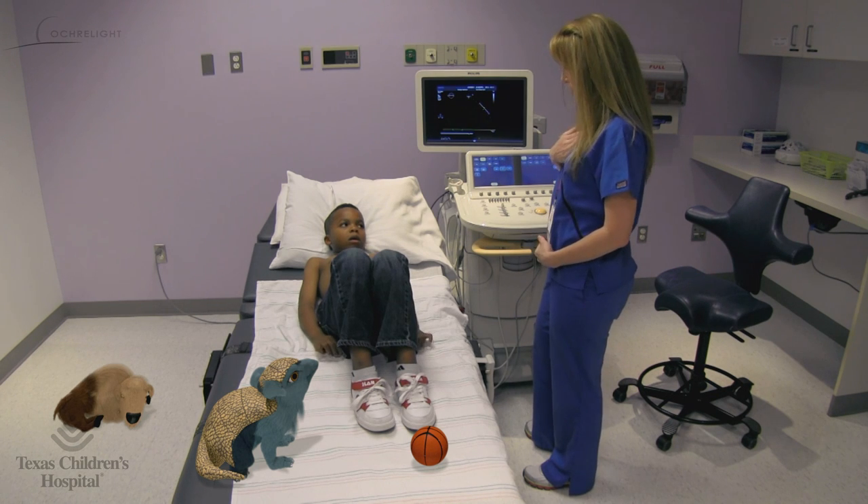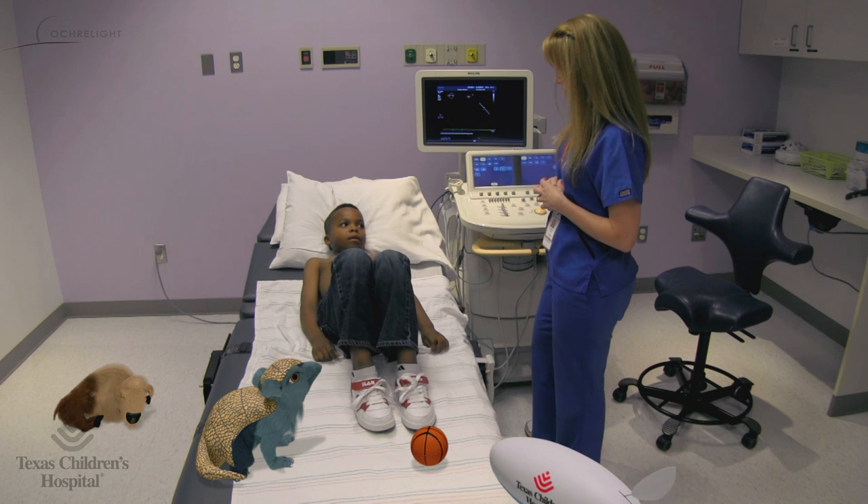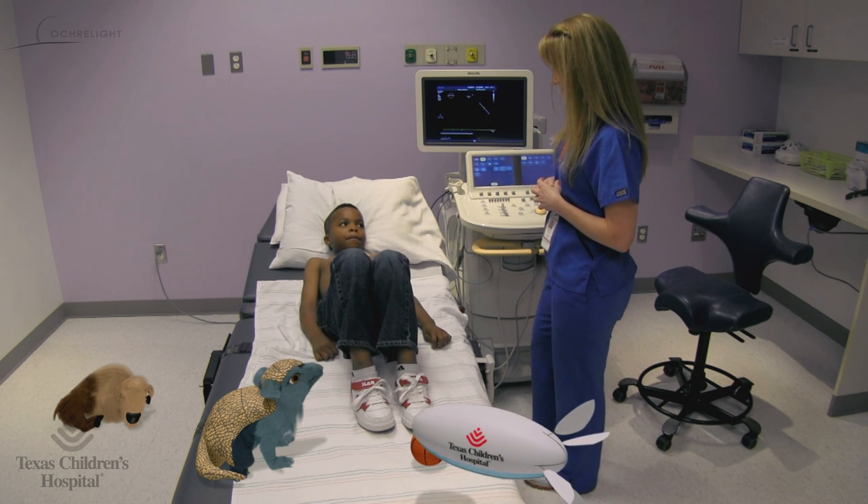Hi, I'm Allie. I'm your echo sonographer for the day. And we're going to do a test called an echocardiogram. That's a big word.